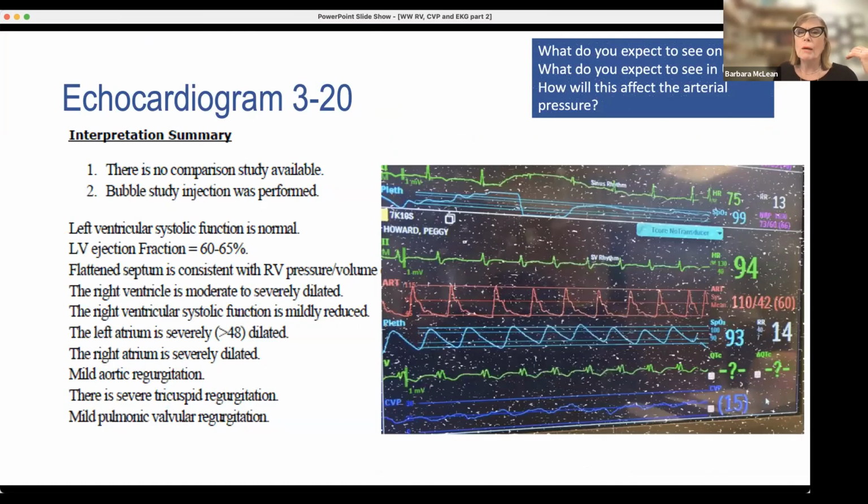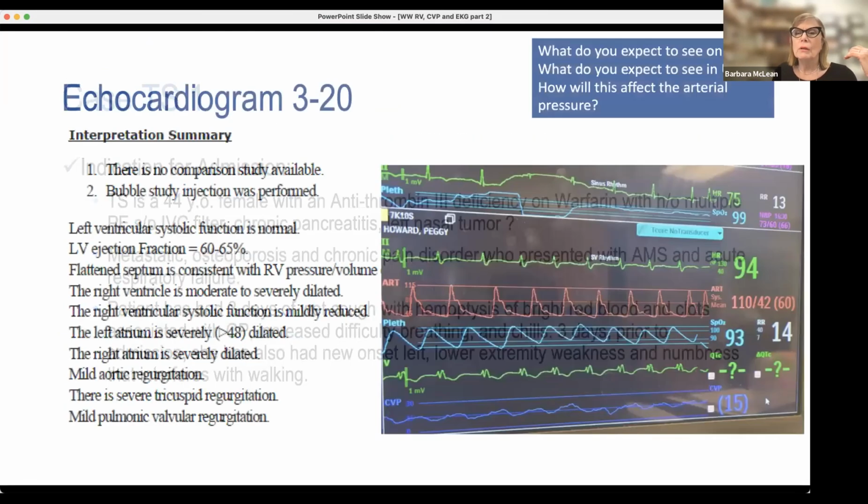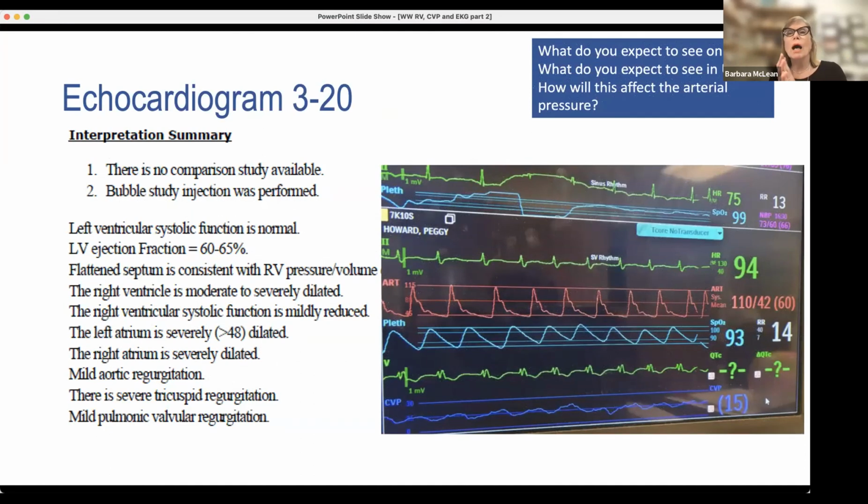Okay. I don't know why we're going back to that. Okay. All right. So I go to see her and I say, oh, guys, you got a triple lumen. Can you hook up a central line? Okay. So central line gets hooked up. You can see her scale here. This is her 0 to 30. And here's her waveform analysis, right? Oh, how strange is that?